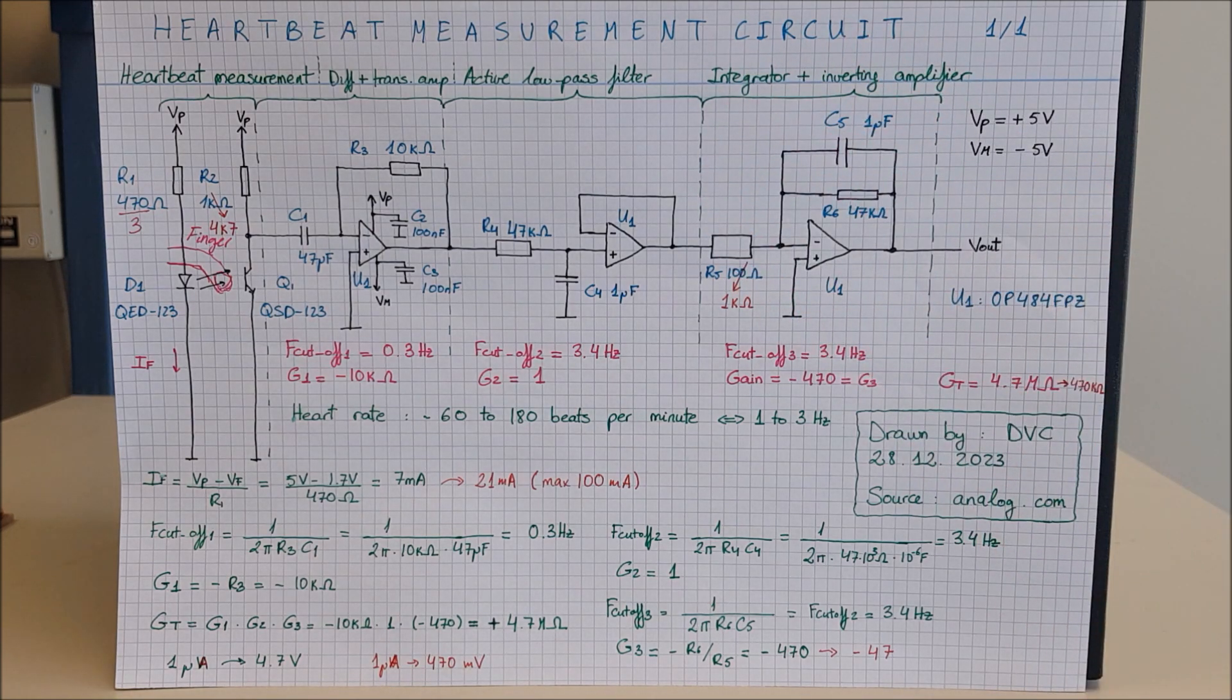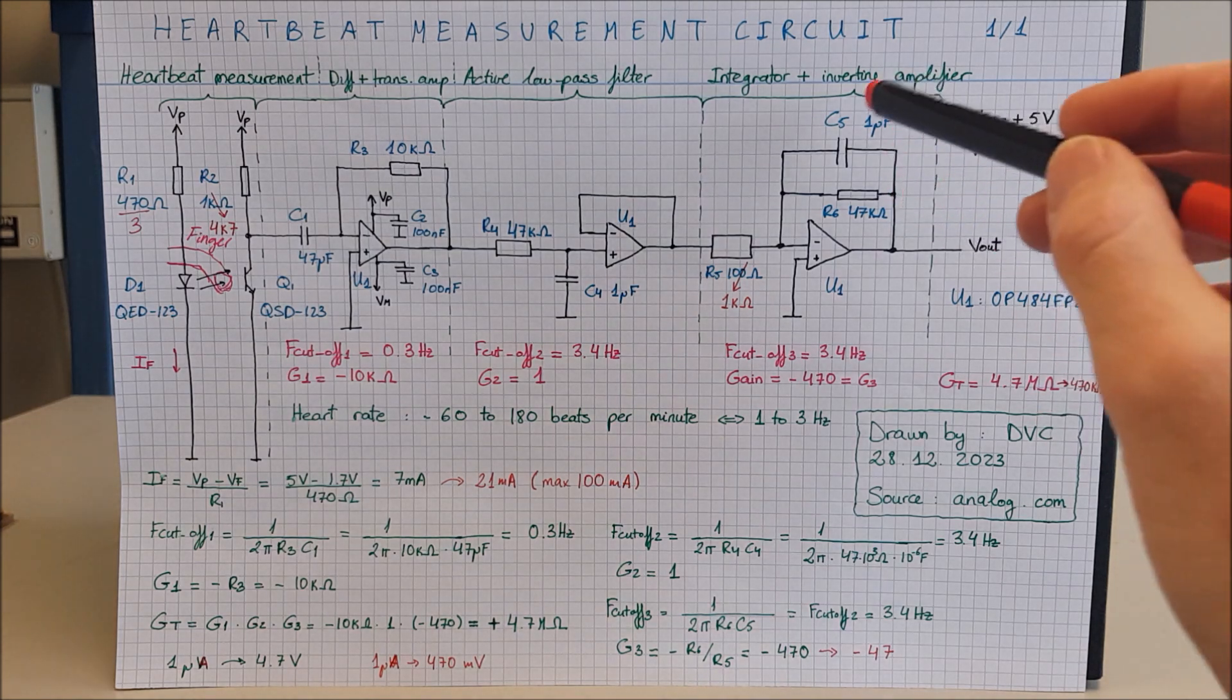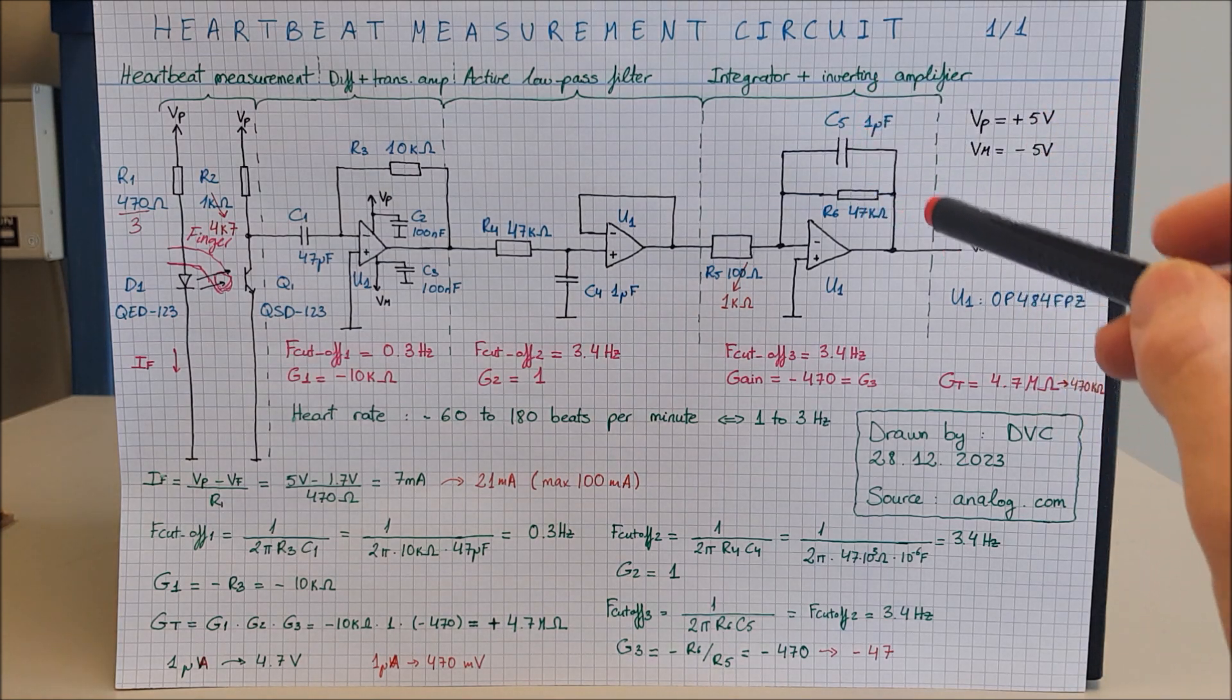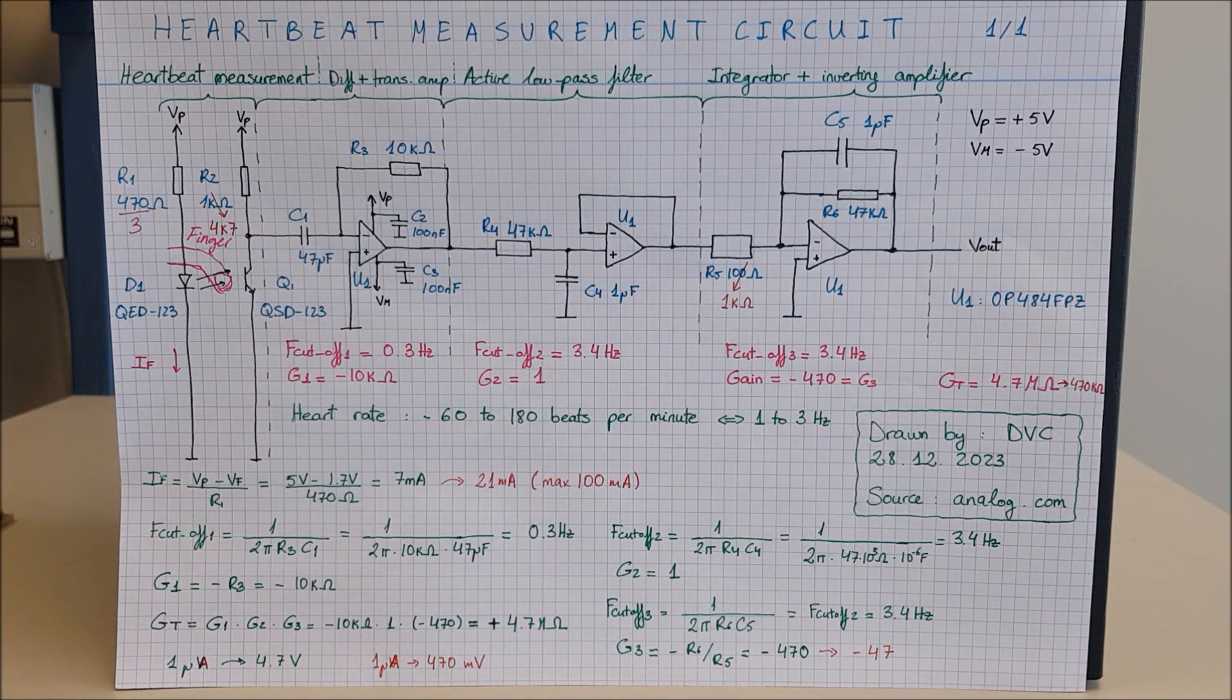Moving on, let's look at the last stage. We want to further amplify the signal and filter it. To do so, we are using an integrator. It's calculating the integral of the signal. Basically, this is a low-pass filter with a frequency given by 1 divided by C5 times R6 times 2 pi. That is again 3.4 Hertz.